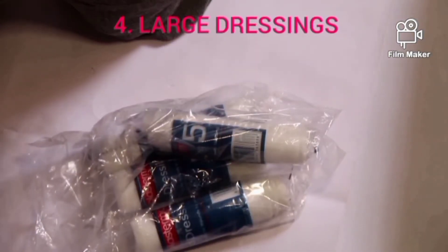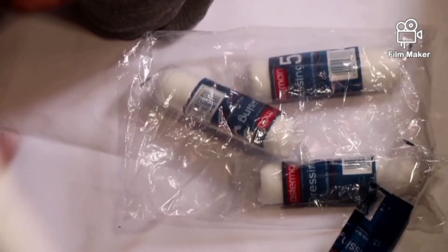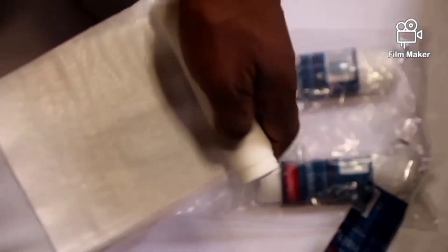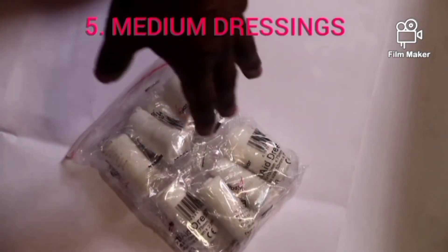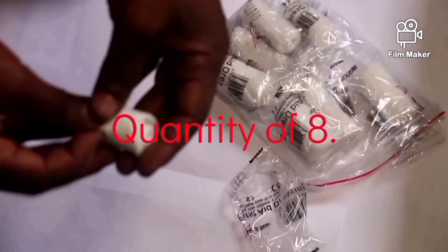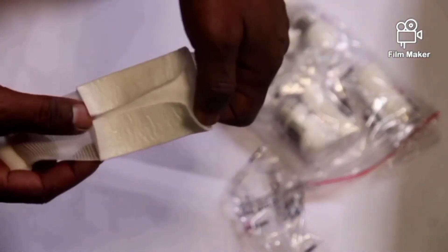The large dressings come in a quantity of four. This is a large dressing and these are mostly applied on large wounds. The medium dressings come in a quantity of eight — this is the way the medium dressing looks like.